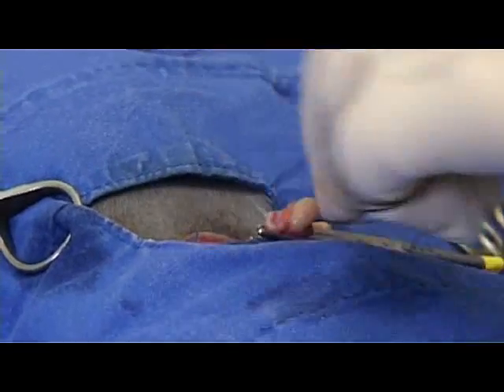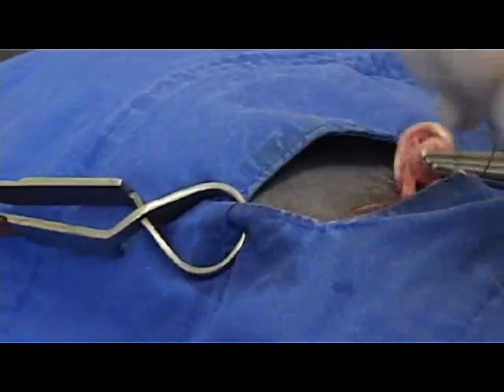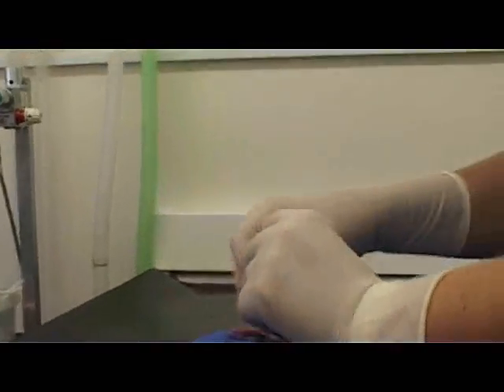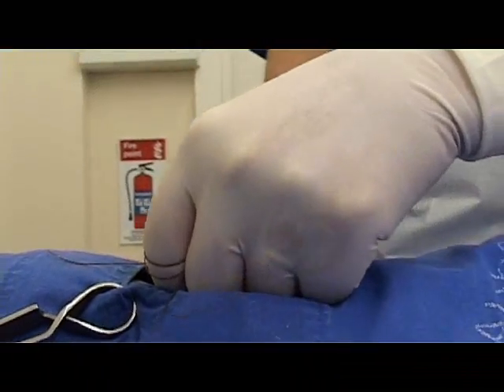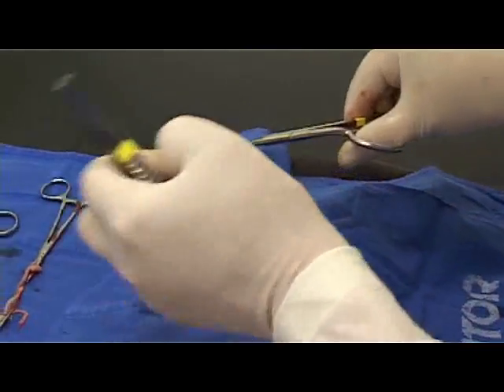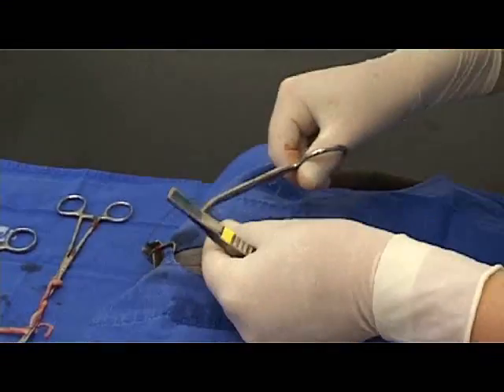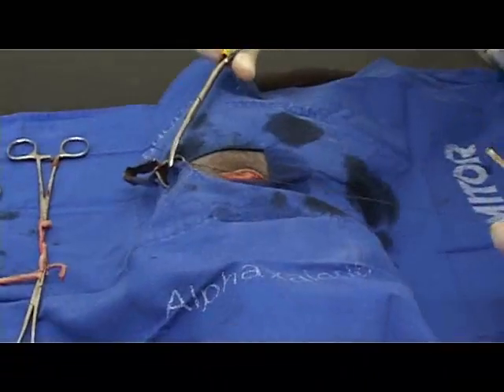The kidney is just under the skin there. There's lots of loops of bowel that you don't want to damage. Bladder's not far away. Just tying off the first ovary so that it doesn't bleed before I cut it. But I mean, it's an operation that we do every day of our career nearly. So it's one of the things that I suppose you get almost slightly blasé about. It's very routine as vets. Although to the cat and to the owner it's very important. It's obviously important, but it's quite traumatic for the owners sometimes too.